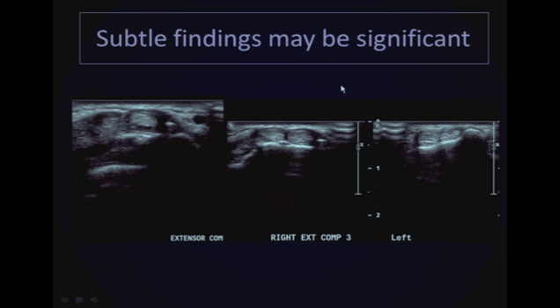Subtle findings may be significant. So even though you see what looks like someone might think of as a drop of fluid or very minimal thickening, comparison with the other side may tell you that these are significant findings, but also, of course, an interaction with your patient. This is a patient who presented with dorsal wrist pain, a dorsal right wrist pain, and right where she points to the pain, we see the extensor tendons.